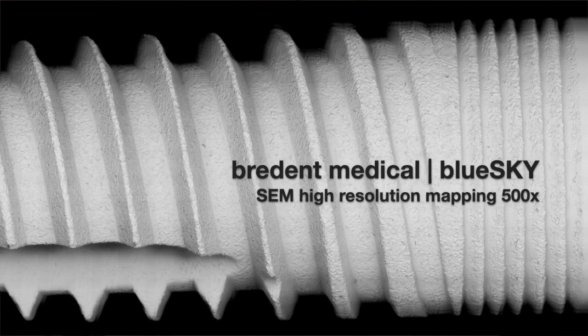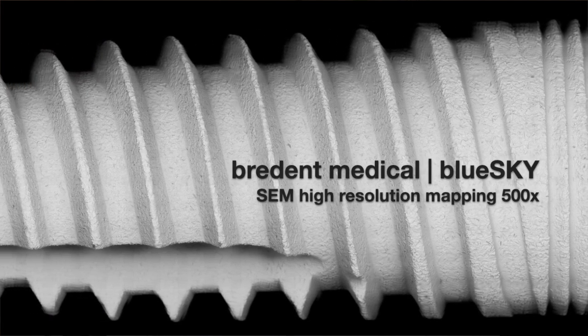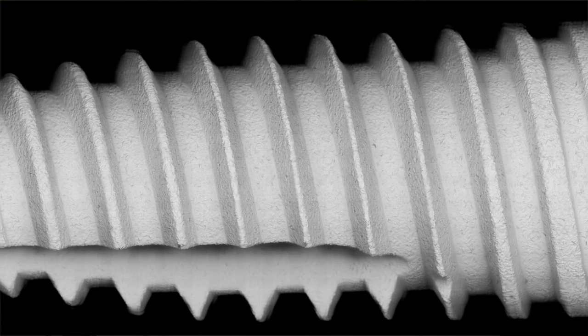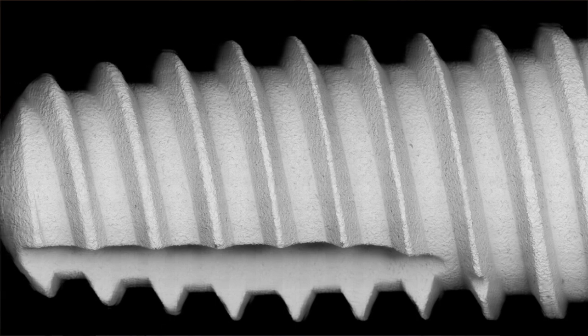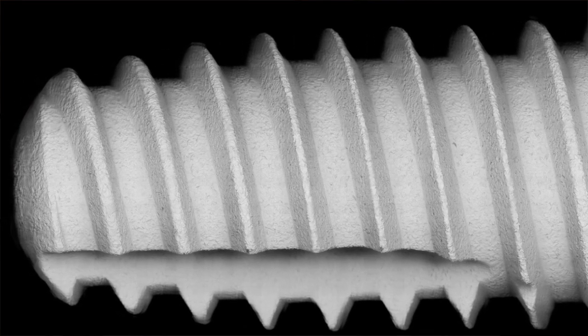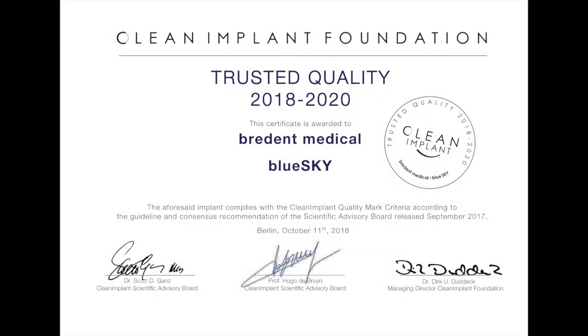This is how a clean implant looks in detail in the material contrast mapping images. It is a technique where we collect more than 400 single SEM frames and compile them electronically to form one big image of the complete implant. You can see the surface from the implant's shoulder to the apex in breathtaking magnification. No cherry picking of nice looking areas. We always have to see the full implant as a basis for any rating.